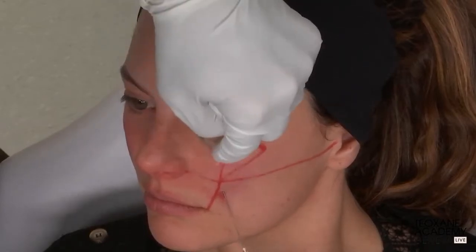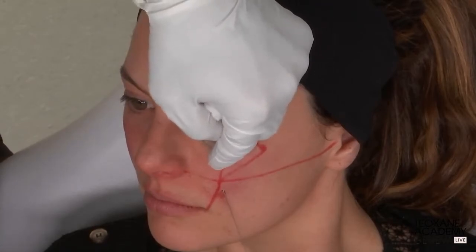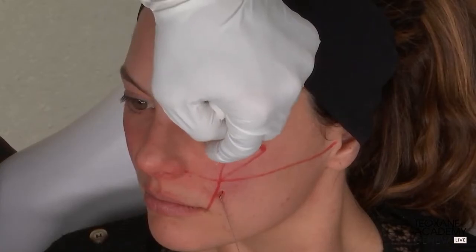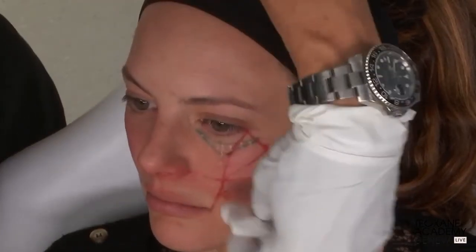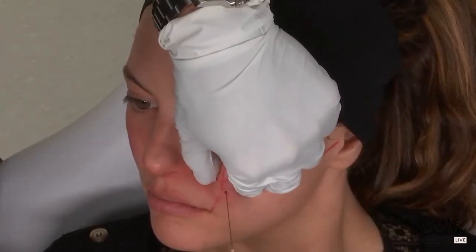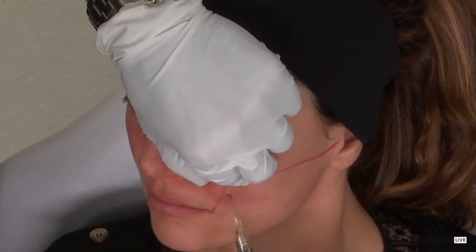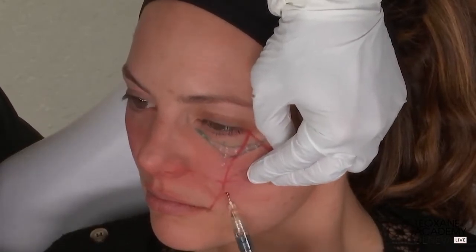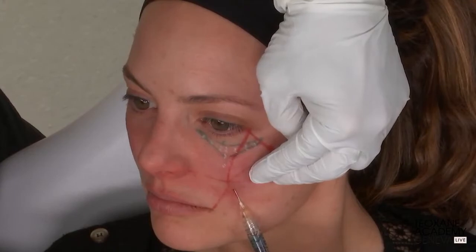So here you are in the tear trough. Yes, this is the center, the V deformity. From here, these 3 points are basically a confluence between the two defects, the tear trough and the nasojugal, but the other two are definitely in the tear trough. So if we count the cc of product injected straight in the tear trough, you see here, I'm all the way up and I deliver 0.02.